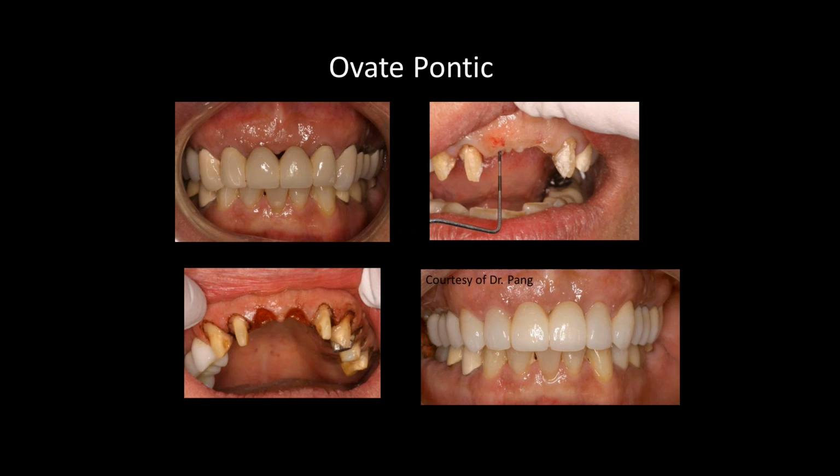Again, you can see the final case and how the teeth just look more natural coming out of that tissue. And what I like is that now you've got papillae reintroduced into the gingival embrasure areas on these bridges.